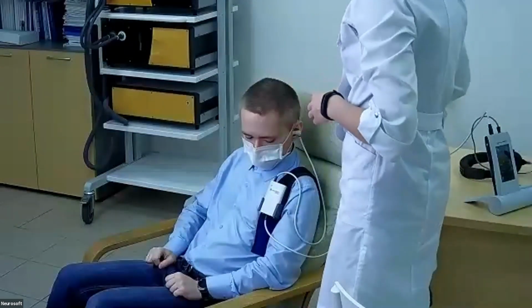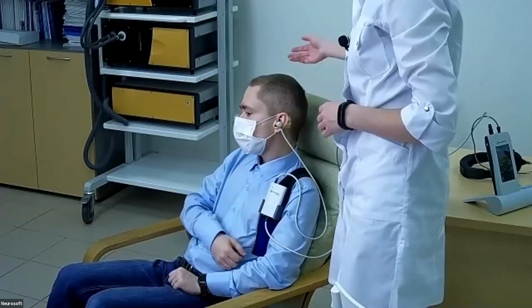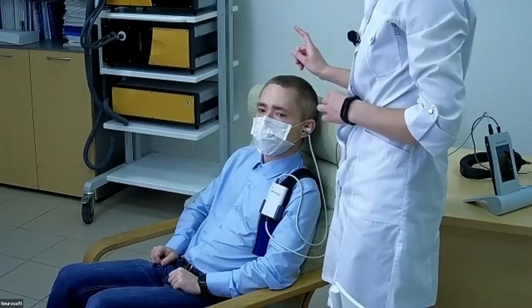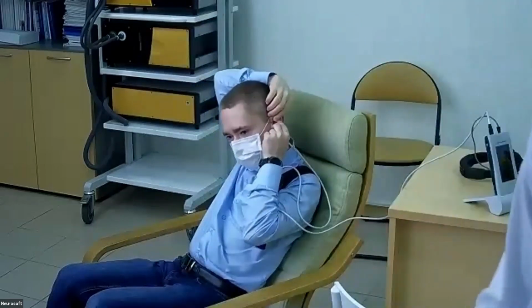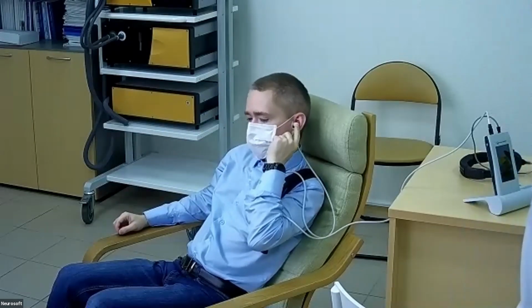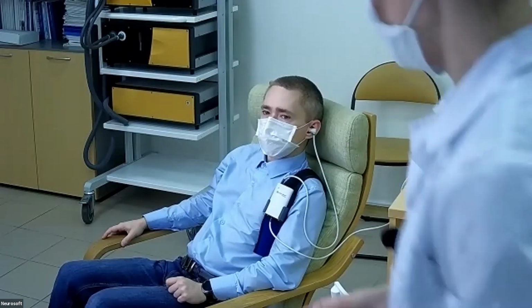We have put before 2 electrodes on the mastoids, on the left and on the right side. And now we should put 1 electrode more on the forehead. I will prepare the skin as we did yesterday. Firstly, I will degrease the skin with spiritus.